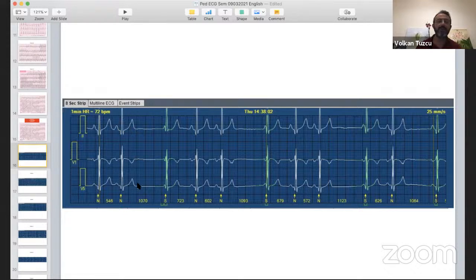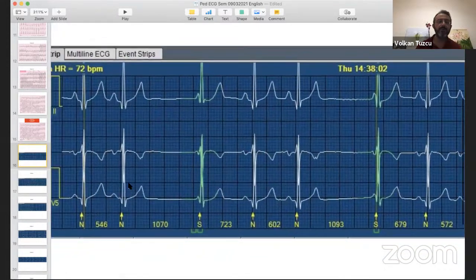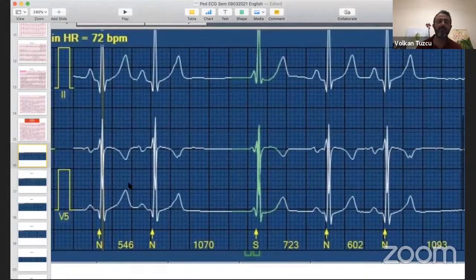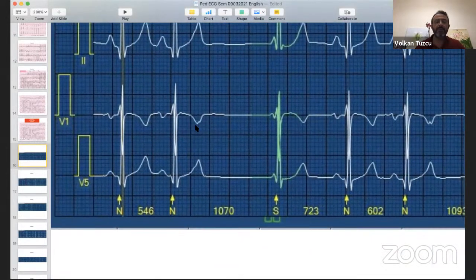Look at the T waves actually, just before the pause. Compare them to the ones before, okay? I know it's difficult. Let's zoom. We like things on T waves in EP. Always remember this, and always compare any ST segment and T wave to the ones with the sinus. So the first one looks a little bit peaked compared to the other. Look at this one. Maybe there's a notch here. And again, this is different.